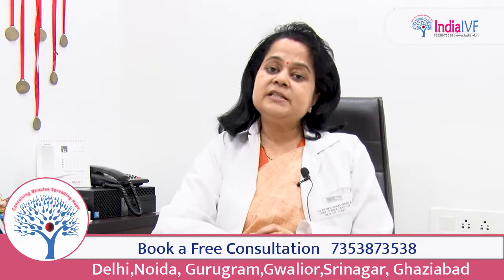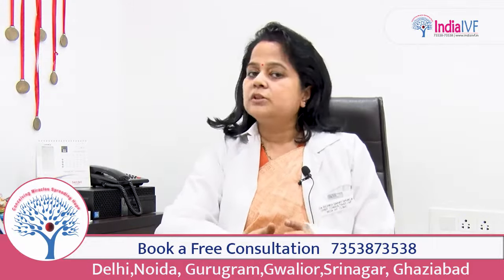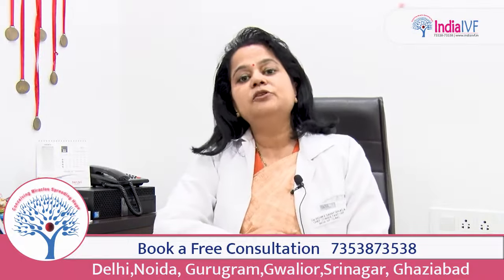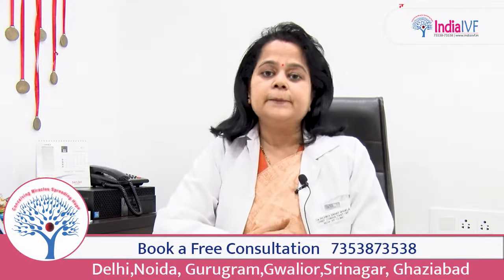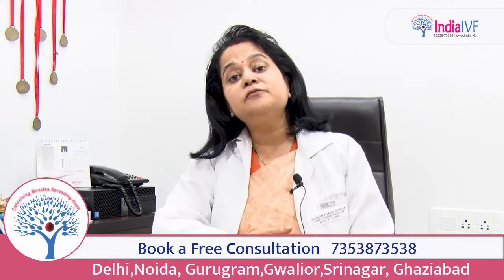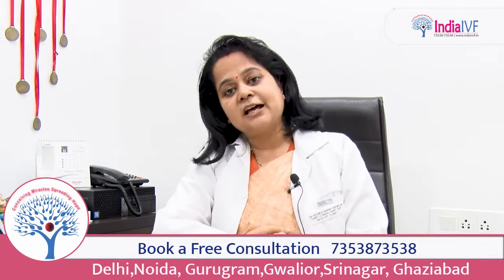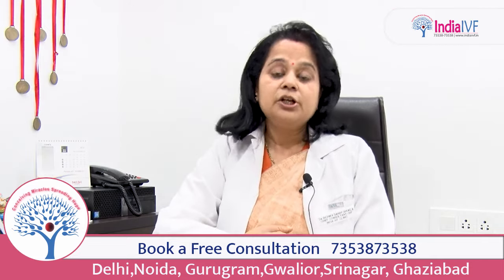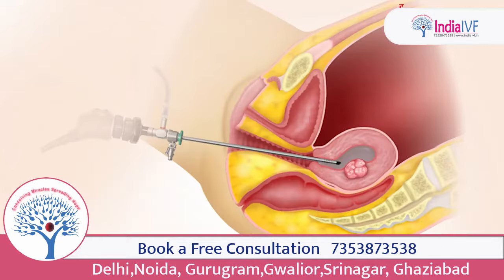So when do we basically need a hysteroscopy? Do we need to do it in all cases? No, definitely not. There's no recommendation that we should do it in all cases undergoing an IVF cycle. But definitely, if the ultrasound, which we do as a 3D scan or a 2D scan, is showing any defect or pathological problem, or the patient is having recurrent implantation failure or recurrent abortions with no definitive diagnosis, in those cases we should definitely do a hysteroscopy.